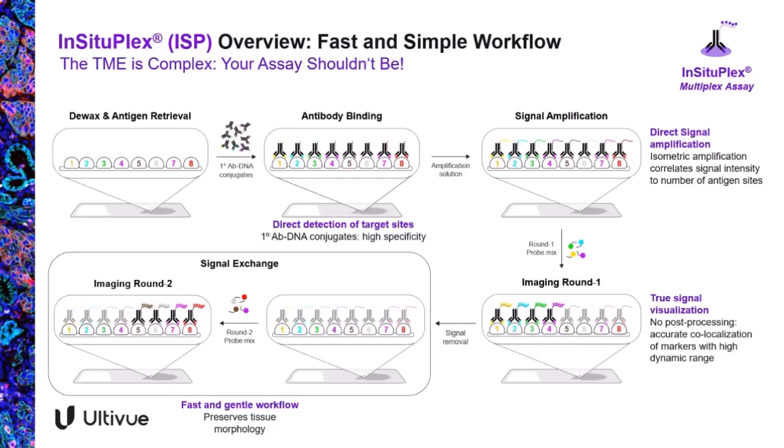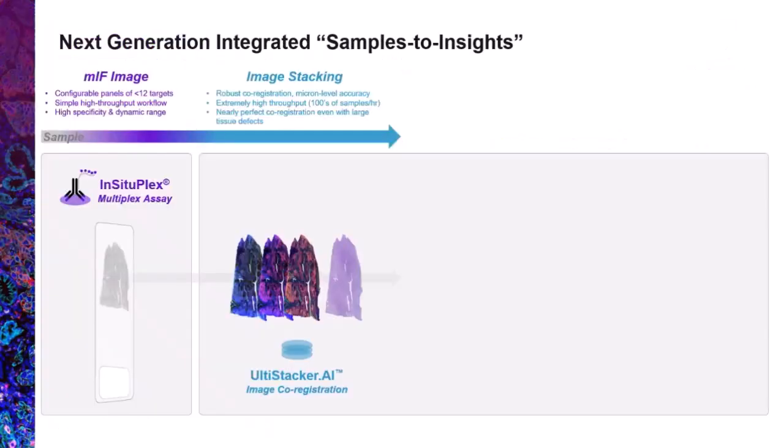We like to do an H&E to bridge the molecular-focused multiplex immunofluorescence with classical pathology, but other techniques are also possible. Which then brings us to the next step that can be challenging. You have multiple scans and you have to put them together, ideally in subcellular resolution, so that you can combine the markers coming from different rounds of imaging, so that you can really do deep phenotyping and excellent colocalization.